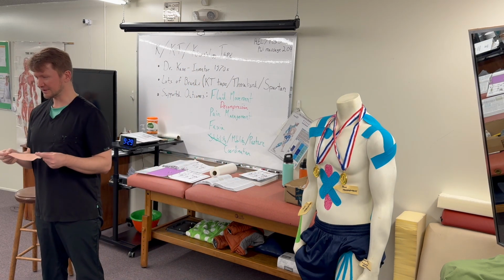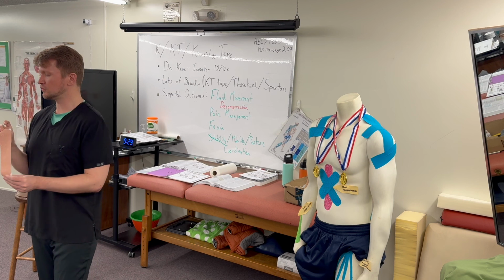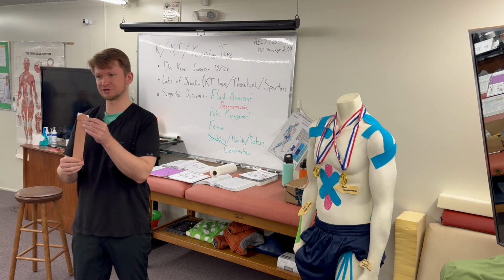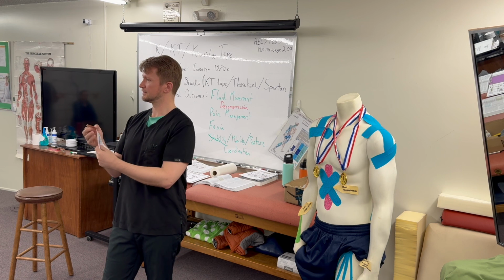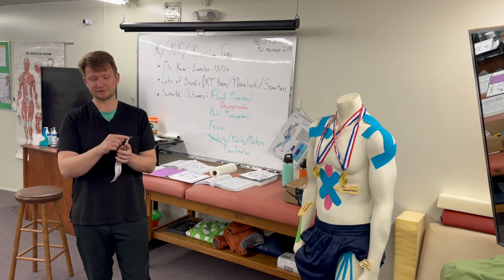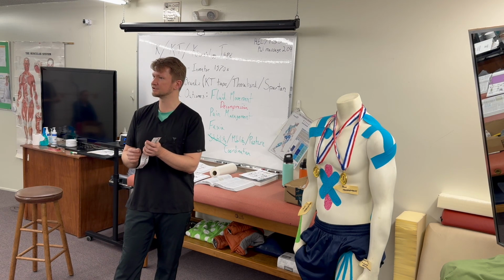Now, to get into the fun stuff. One thing too, this is just for convenience. You all have the boxes where this is a pre-cut version of the tape, and the pre-cuts usually come in these dimensions, about a foot. What's nice is that there are rounded edges here. As I teach this, I'll show the process of cutting to round the edge.